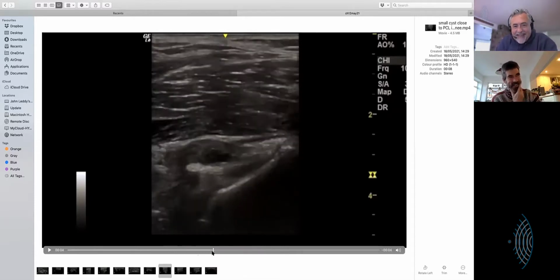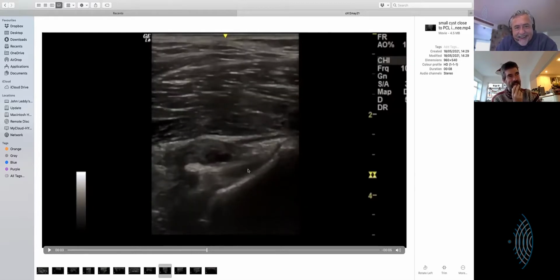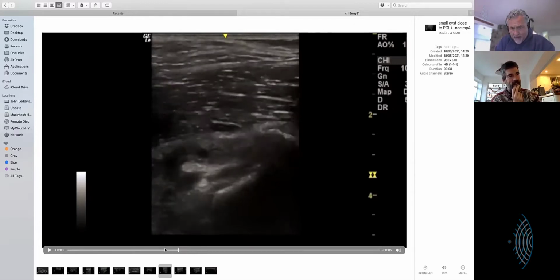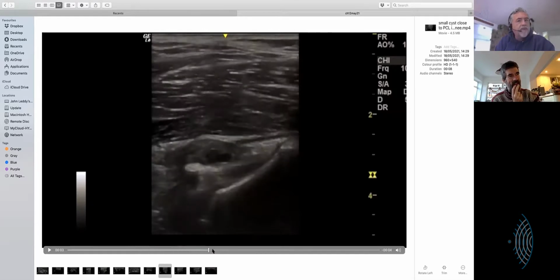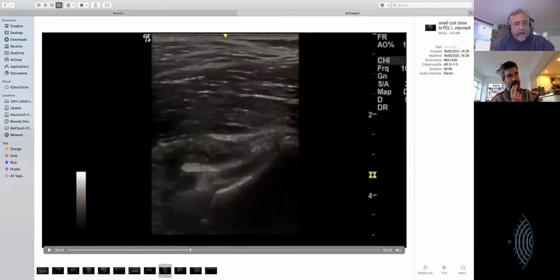This can't be hip then. No, this is a PCL. Oh my goodness! That's a little cyst wrapping around it. John, I want you to help me know where the probe is. Are we posterior here, or do we have to be behind?